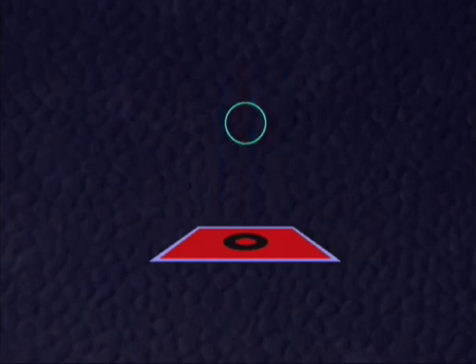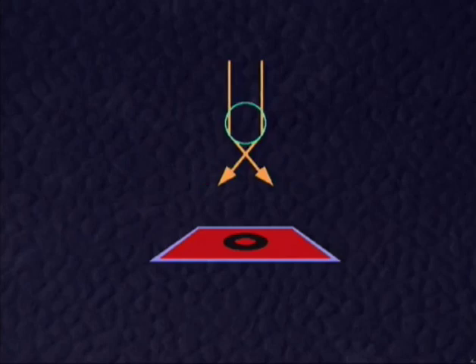In case of a lower index of refraction, they diverge directly. In case of a higher index of refraction, they diverge after having converged first. Therefore, the peripheral rays do not arrive at the observer's eye. As a result, the margins of the observed object will always appear black, while the surroundings, as well as the central parts, will be seen in the color of the background.